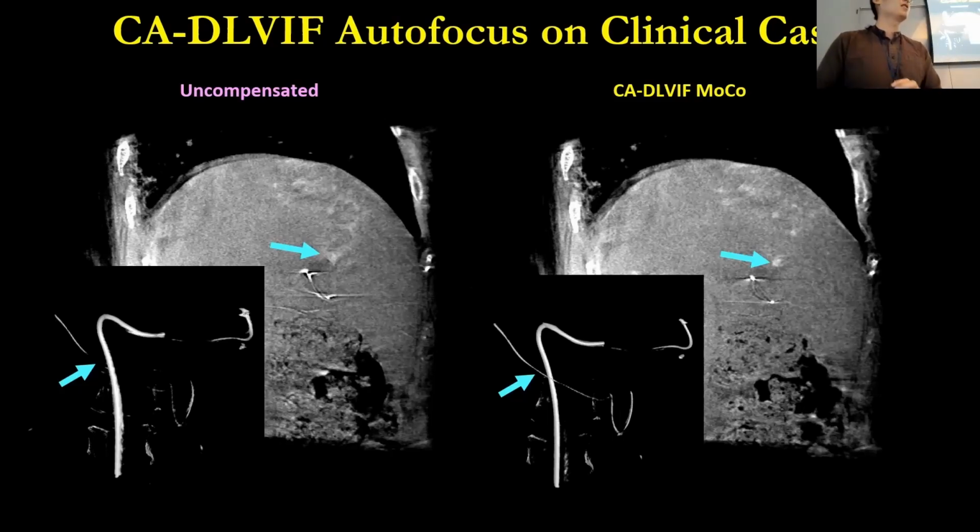And I think there has been other work on this, probably in neurology scans. But we are a little bit skeptical about that because it does not ensure data consistency. Some features may be removed or some features may be added. So that's why we go with this approach, so that we can ensure everything is authentic. We are not creating any crazy structures or removing some stuff.